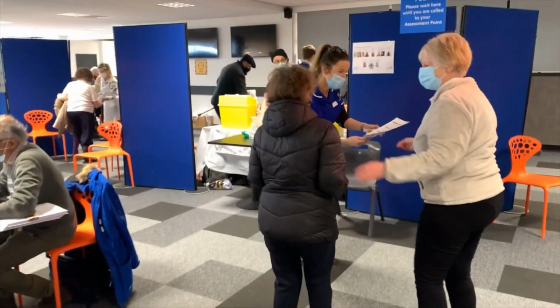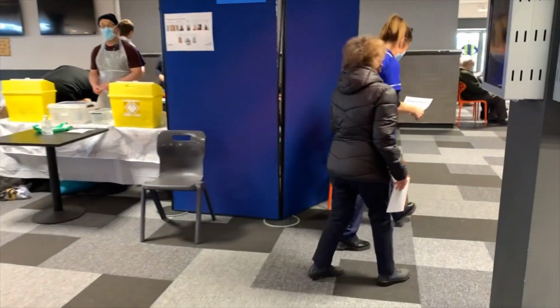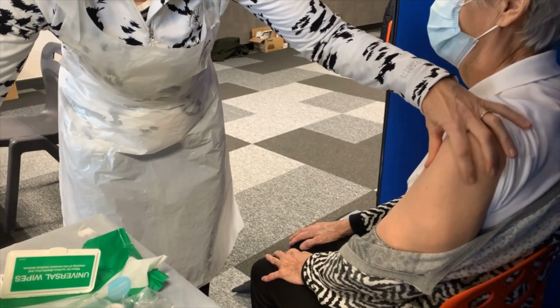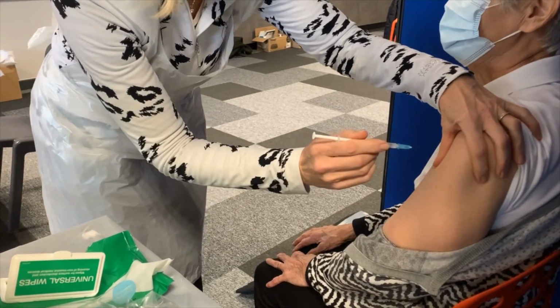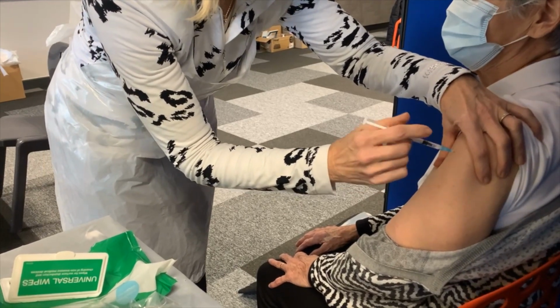Please check that the name and date of birth of the patient matches the Pinnacle form. You must vaccinate into the patient's deltoid muscle of the upper arm. There is no need to clean the skin of the patient with sterile wipes unless the area is visibly dirty.